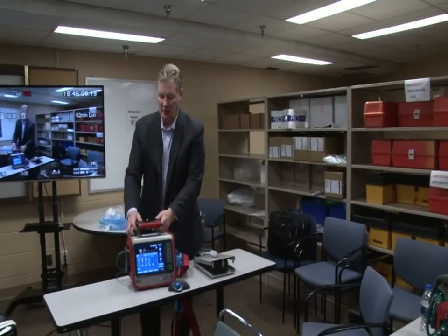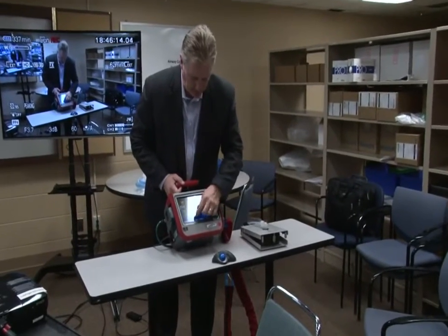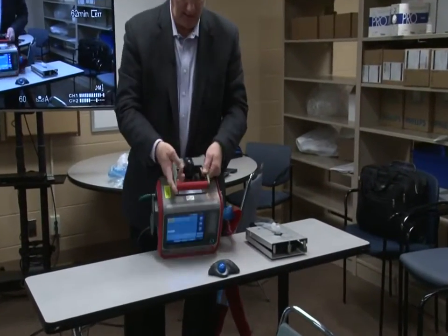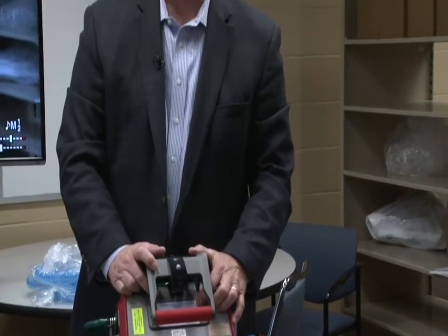That's an excellent segue. Notice on top of the ventilator, there's a little blue sticker with an 800 number. There is always a person with a clinical background on call 24/7, 365, and in the leap year as well, available for you. It's manned live Monday through Friday, Pacific time, 8 to 5. After hours, on weekends and on holidays, it would be picked up by an answering service. Just give them your name and a phone number where they can reach you, and usually within 10, 15 minutes, half hour at the most, somebody will call you back.